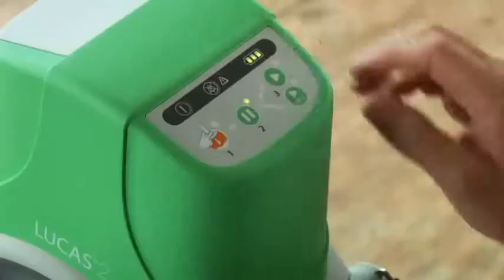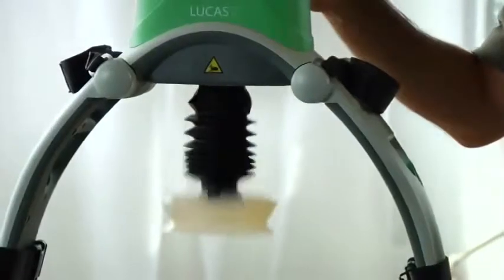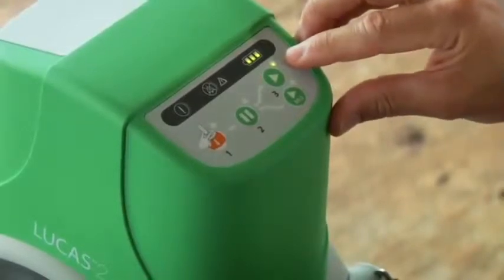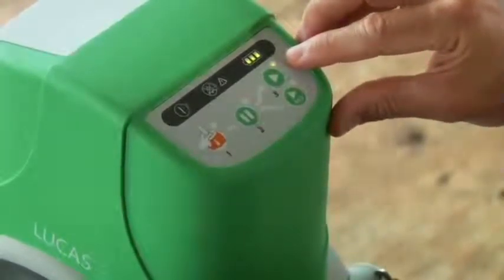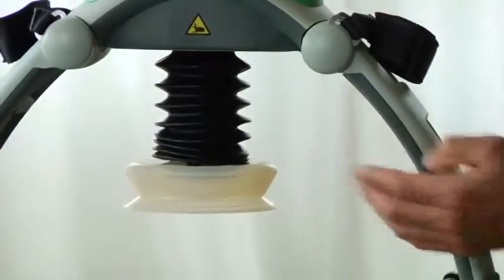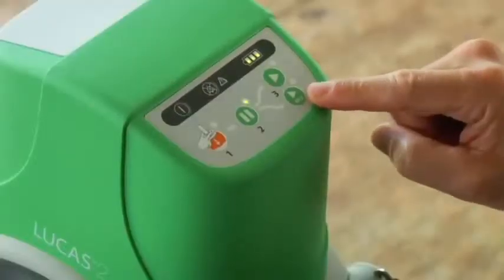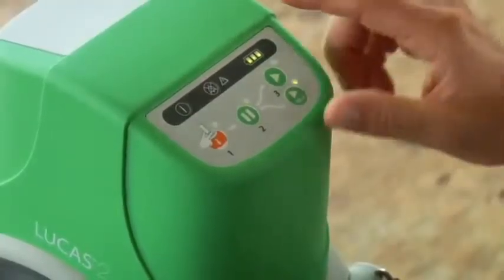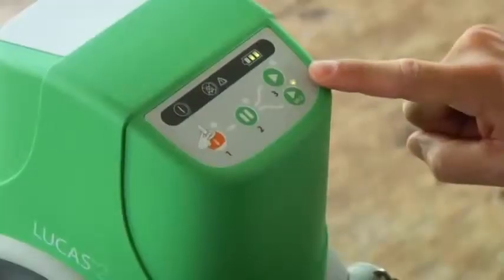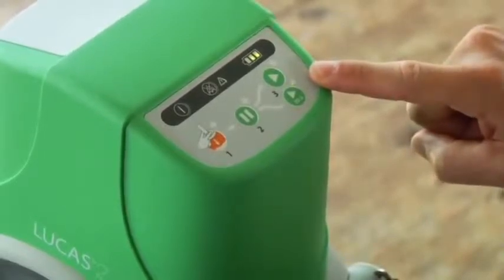Press the active button for continuous compressions. This LED prompts you for ventilations eight times a minute. While Lucas is operating, the pause button pauses compressions with the suction cup up at the start position you set. Active 30 to 2 does 30 compressions, then pauses three seconds so you can give two ventilations. There's an LED to prompt you and also an audio signal that alerts you just before each pause.